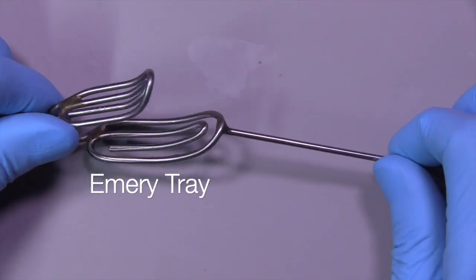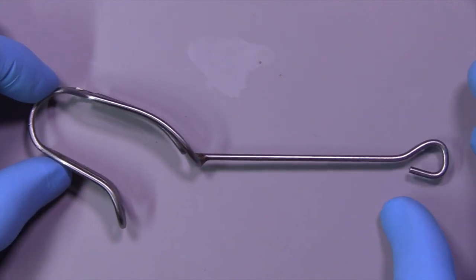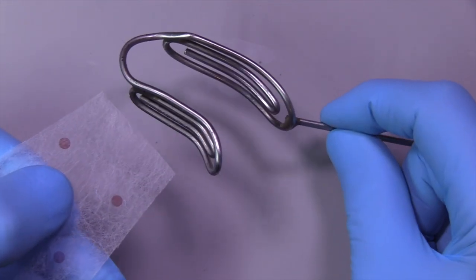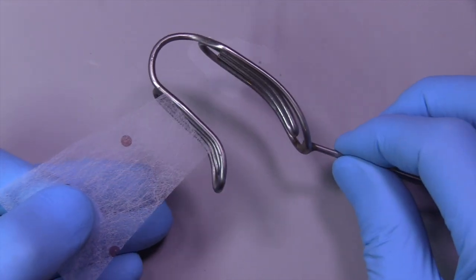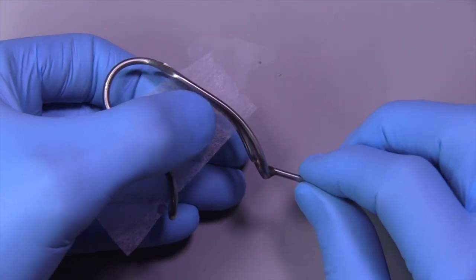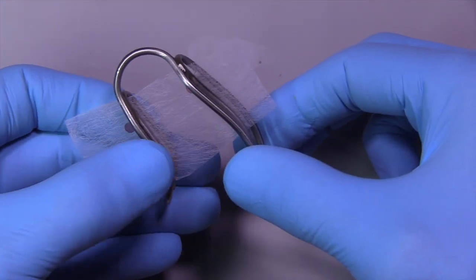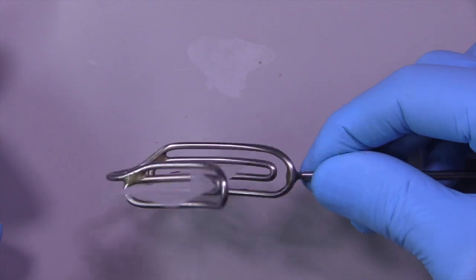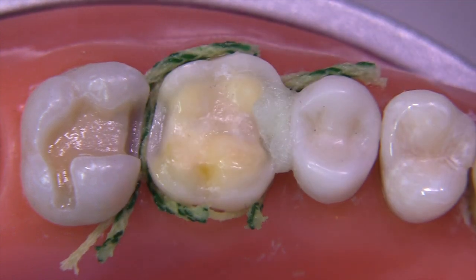This little Emery tray — unfortunately these are not being made anymore, but you can still get them on eBay and other locations. They are fantastic because they're very high-grade steel and don't distort. You can take a piece of coffee filter paper, trim it to fit between the slots, and secure it with wax or, in my case, a clear PVS bite registration material. This is great because it fits in almost anyone's mouth, you can bend it to adjust it if necessary, and you can use it over and over again.